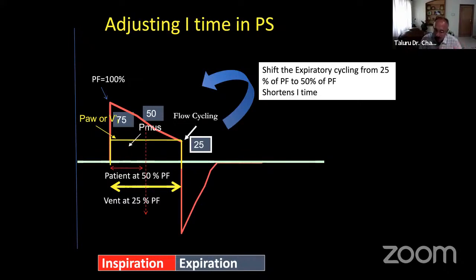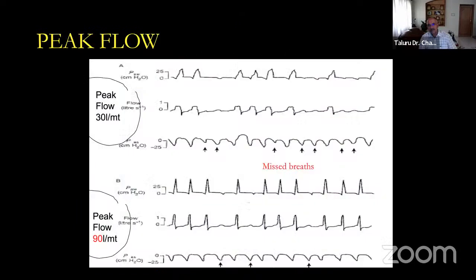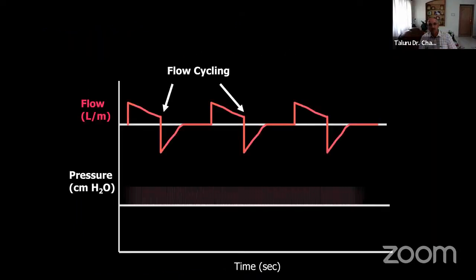Whereas in an anesthesia situation, it is very easy. The IE ratio can be increased. But in pressure support, when the patient is breathing on his own, this is how you manipulate the IE ratio. Just skip these two slides.